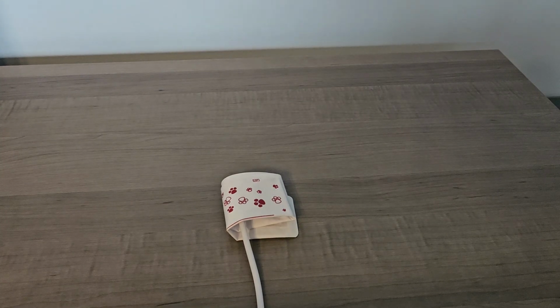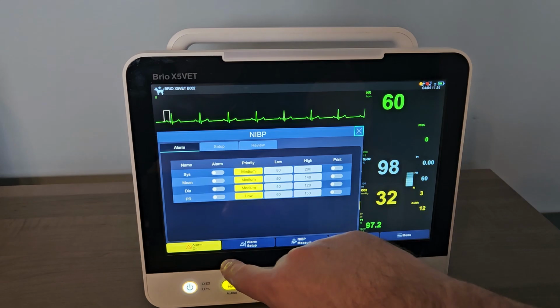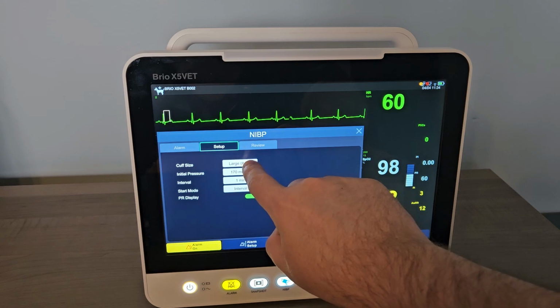The cuff must be at the same level as the heart for best accuracy. Cuff size must also be set in your monitor before reading. To set cuff size, tap on the purple-colored numeric box for your NIBP reads. Then tap Setup in the tabs above and select Cuff Size.